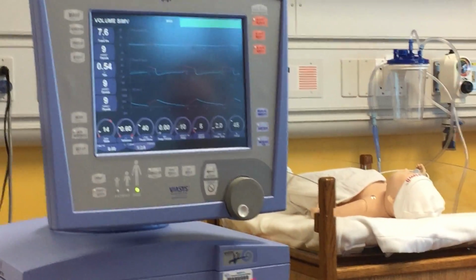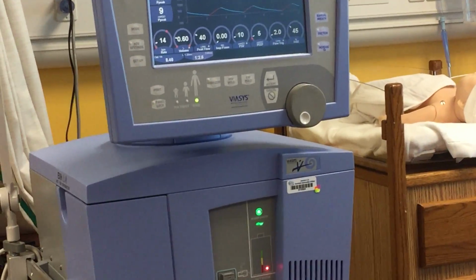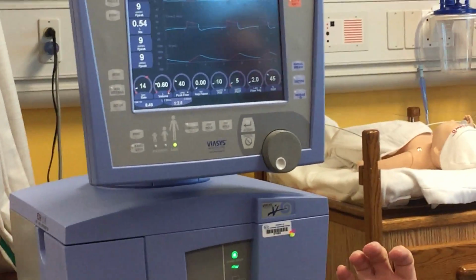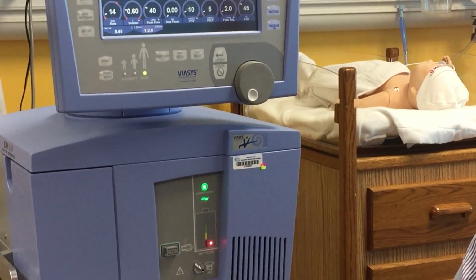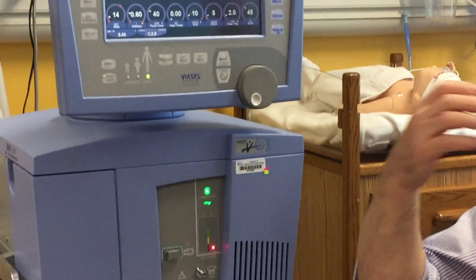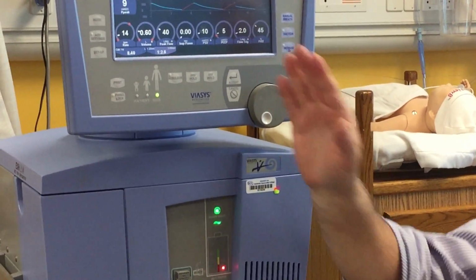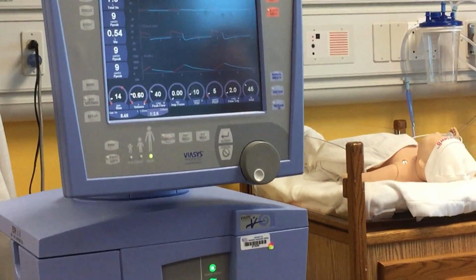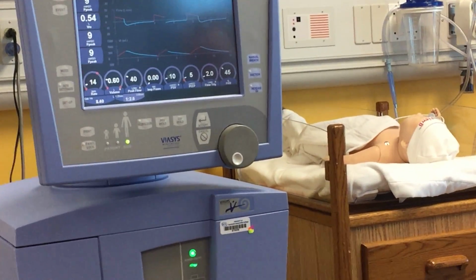Okay? Because the ventilator takes an average of about a minute's worth of breaths. And you'll need that when you set your alarms. If you set them too soon, they're still changing, and all your alarms are going to go off. And then you're going to get nervous, and you're going to think you did something wrong, and you're just going to start making a lot of mistakes. Set your settings. You're with me, if you're with Katie, just sit here and talk to us for a few minutes and let everything stabilize here for your settings.